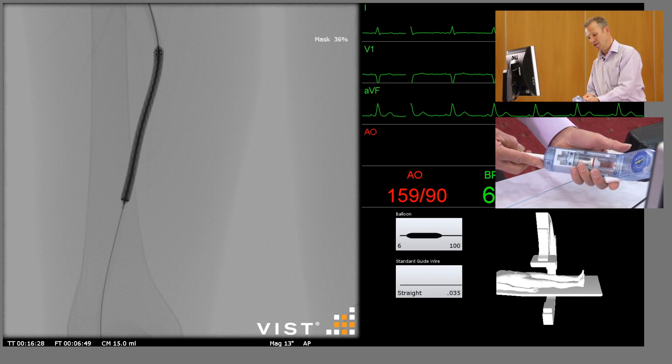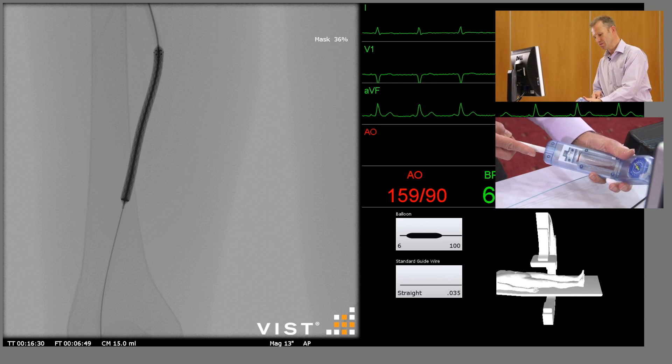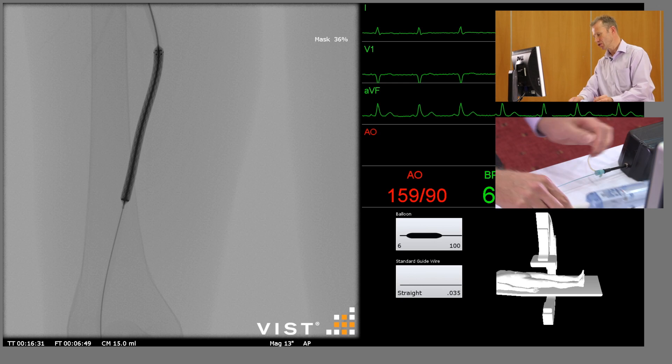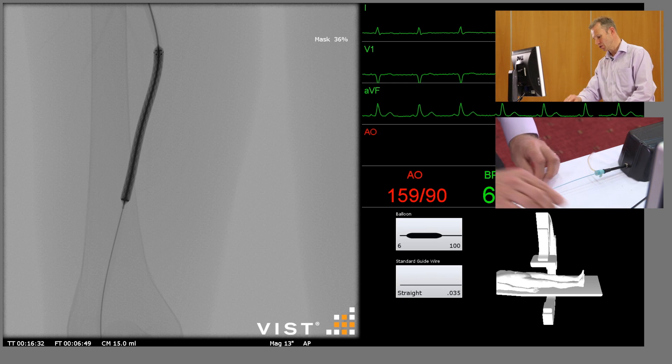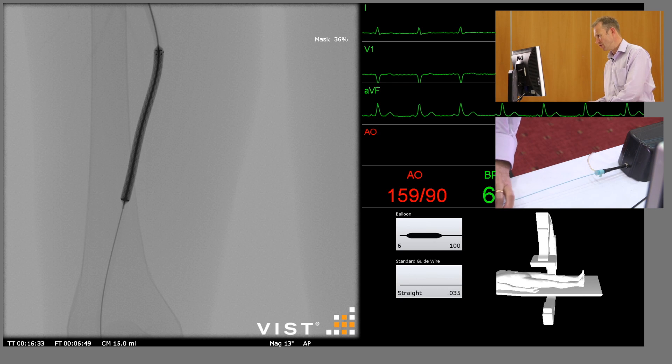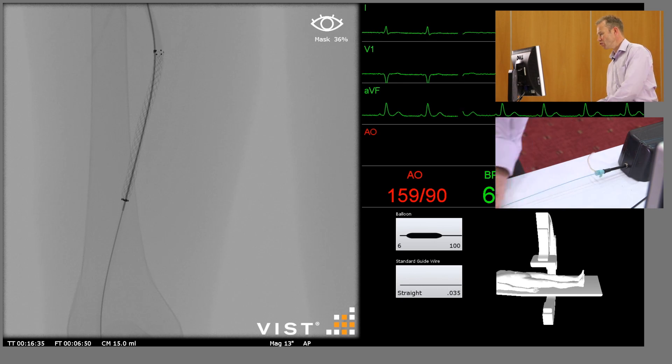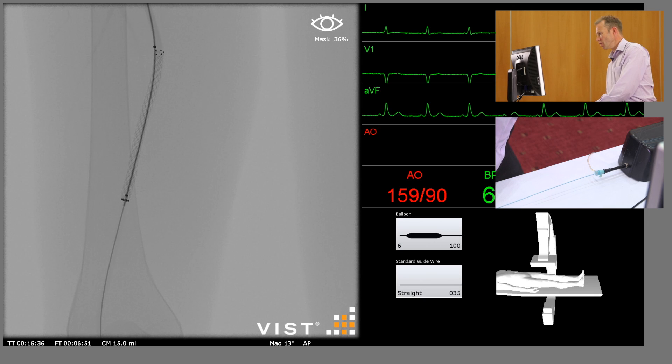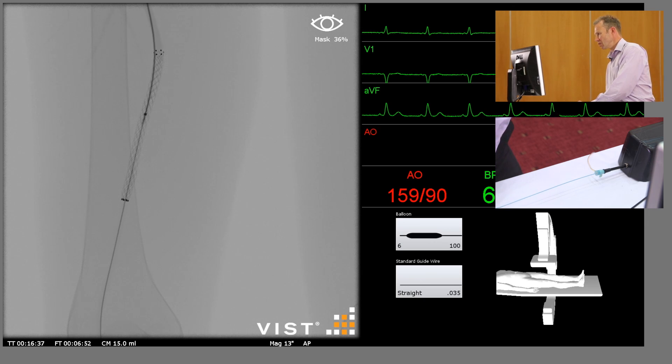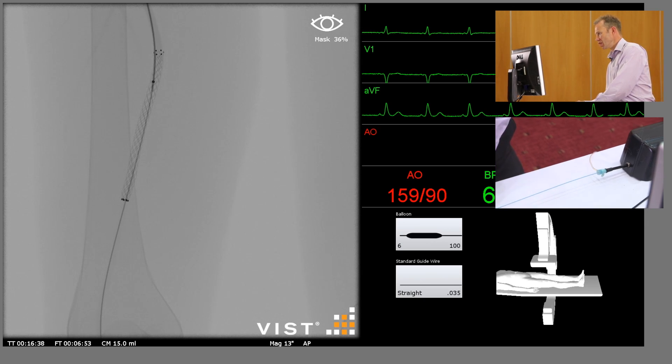Now going to release the mechanism, take the pressure off the balloon, which should deflate the balloon. Now we can slowly withdraw the balloon whilst fixing the guide wire in place once again.